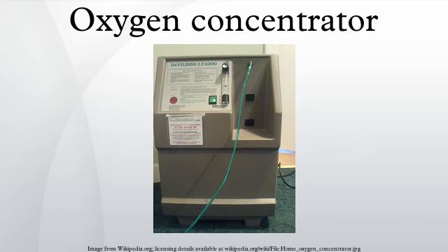An oxygen concentrator is a device which concentrates the oxygen from a gas supply to supply an oxygen-enriched gas mixture. Oxygen concentrators typically use pressure swing adsorption technology and are used very widely for oxygen provision in healthcare applications, especially where liquid or pressurized oxygen is too dangerous or inconvenient, such as in homes or in portable clinics. Oxygen concentrators are also used to provide an economical source of oxygen in industrial processes, where they are also known as oxygen gas generators or oxygen generation plants.